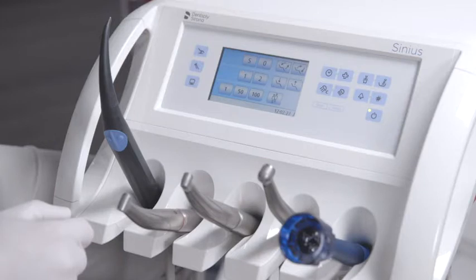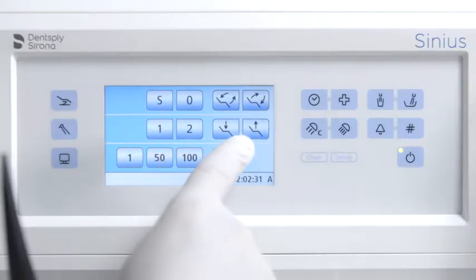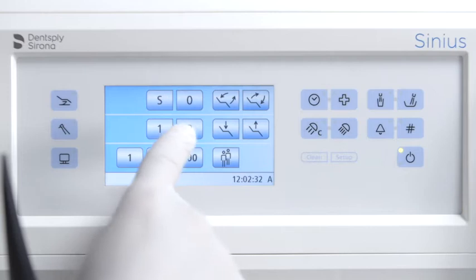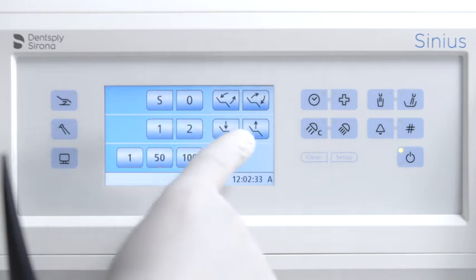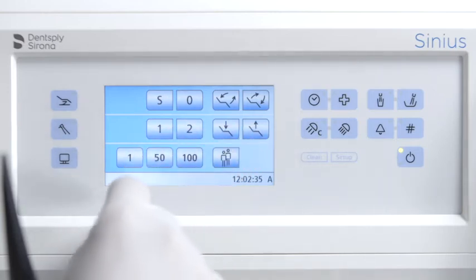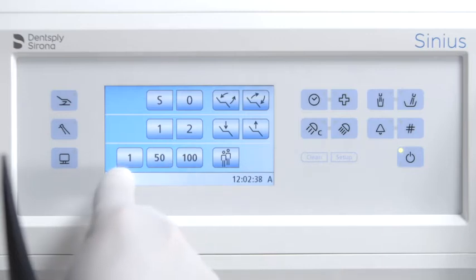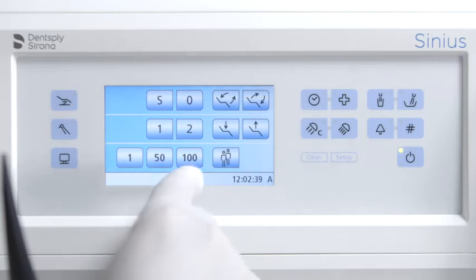The easy mode start program displays the function keys for the patient chair programs and manual chair adjustment, as well as the quick setting keys for adjusting the intensity of the instruments, together on the same screen.